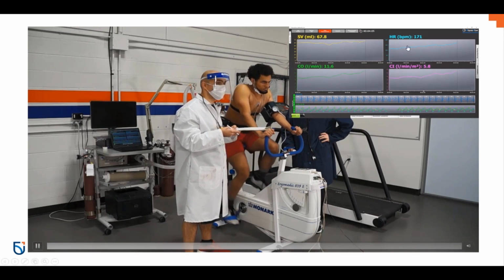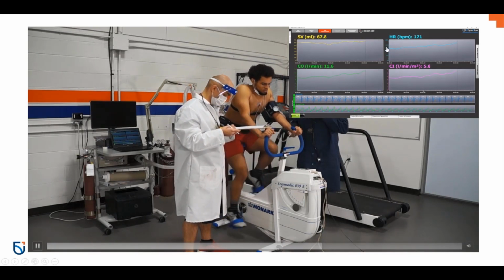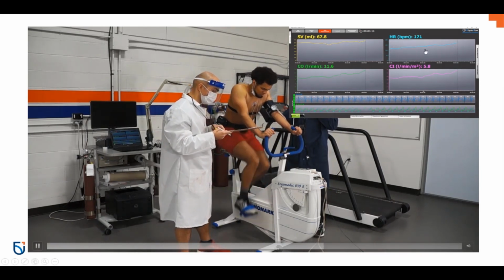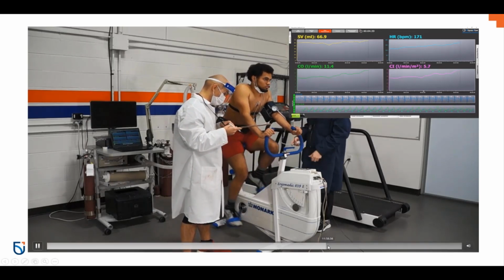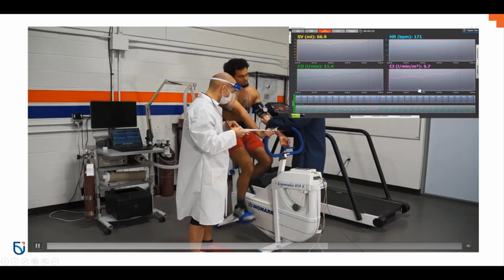Okay, so if we look at our graphs here, we can see that our heart rate started fairly high, around 130, but we can already see it's increasing. It's up to 171, and we're sort of halfway through our first stage here at 140 watts. So we're going to keep moving on and keep an eye definitely on this data up at the top.